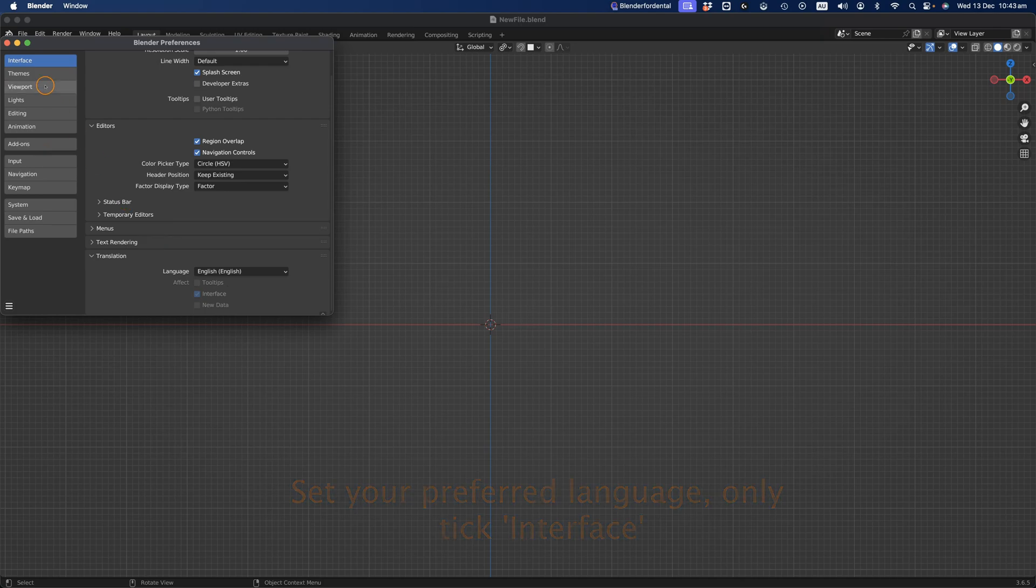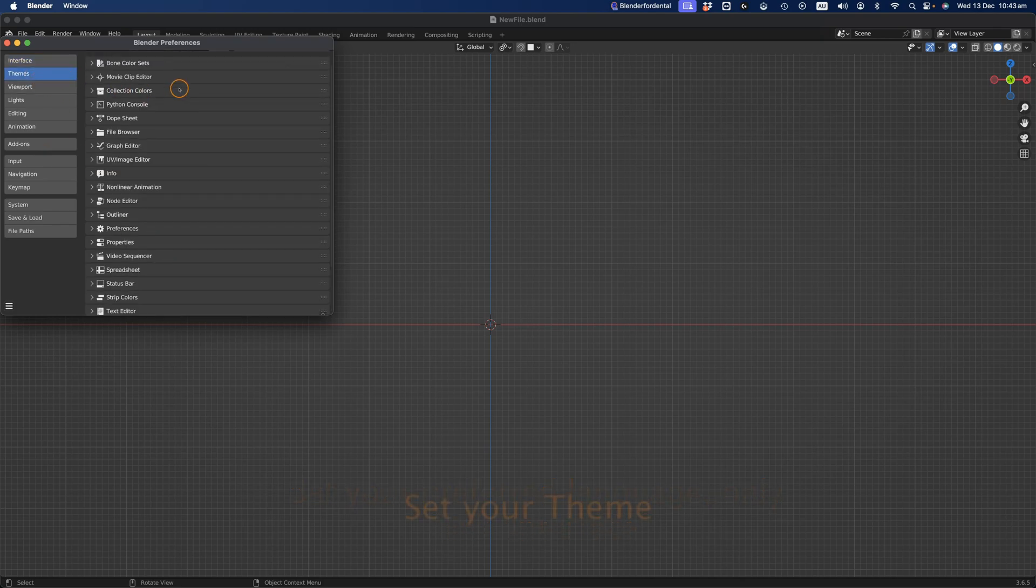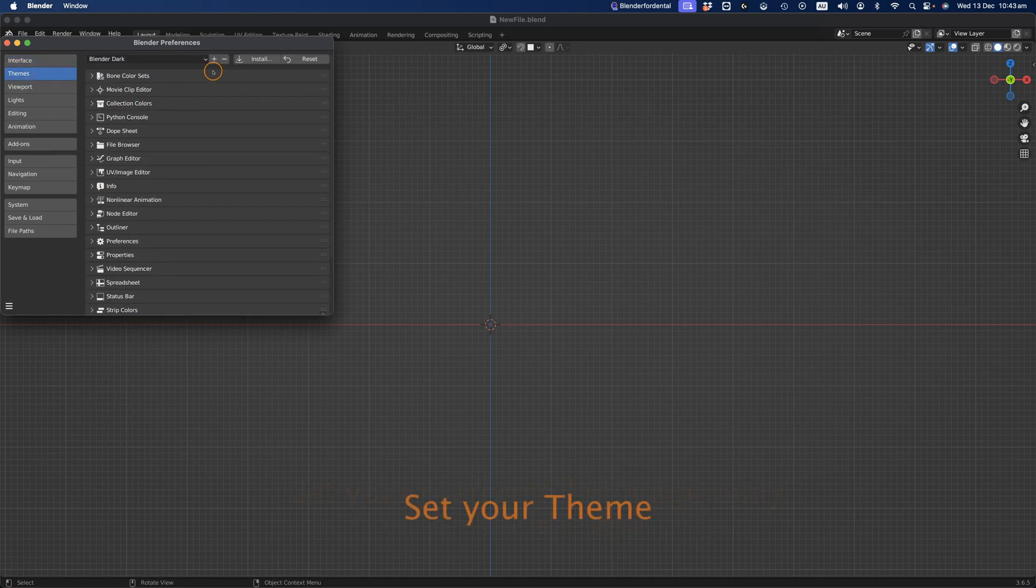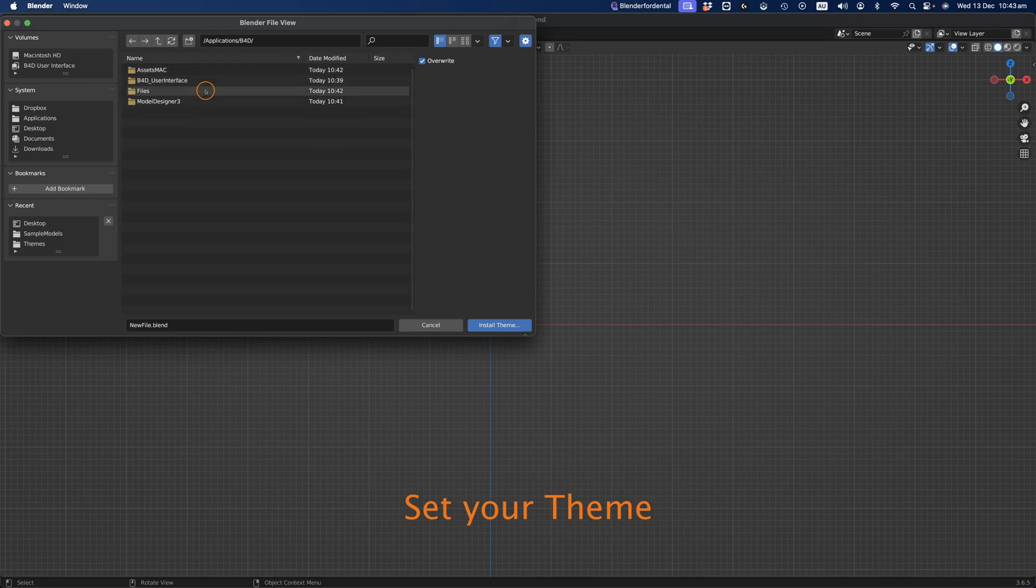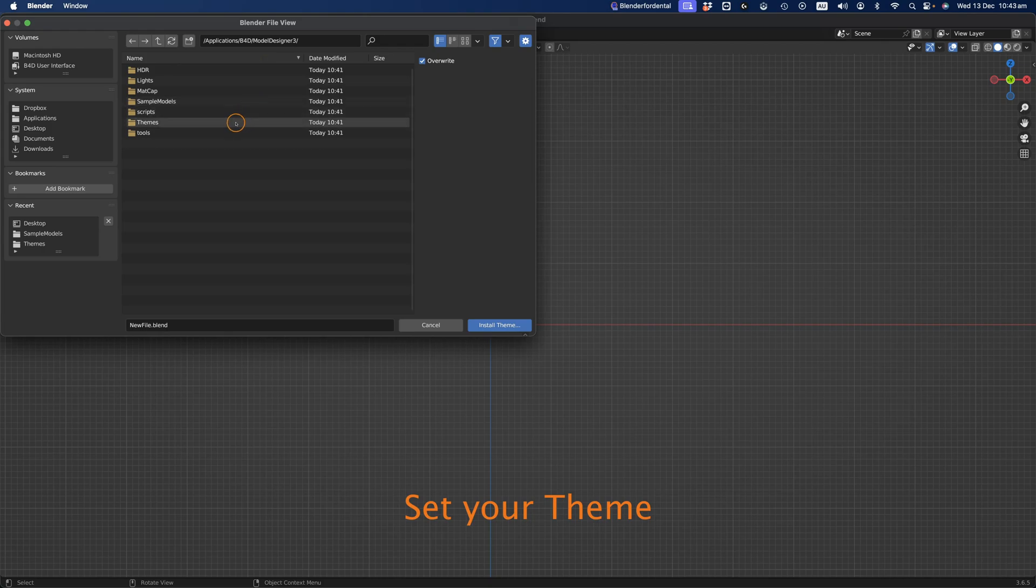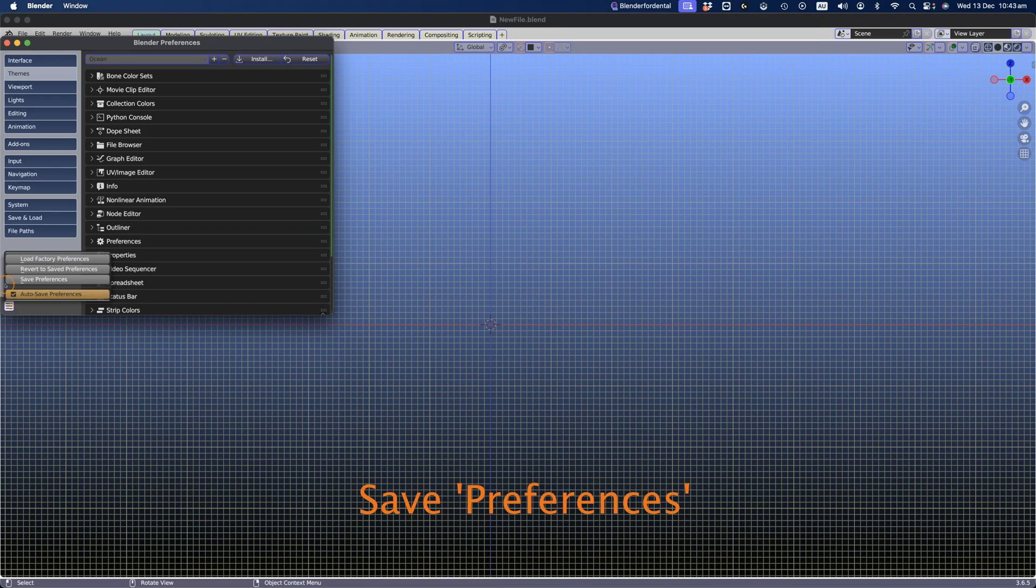Select a theme from either the Blender drop-down menu or the Model Designer Themes folder, included in the Blender4Dental software. Save your preferences.